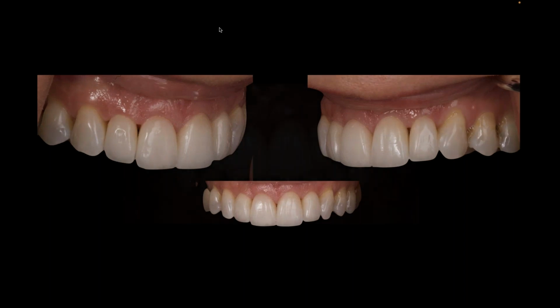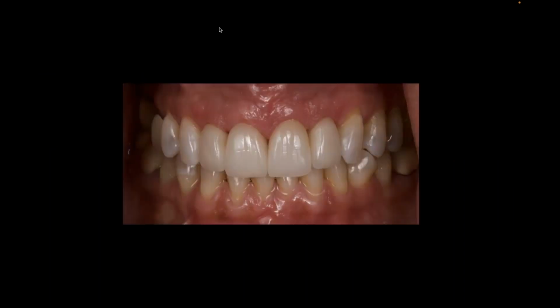And in the end, this was all on insertion, so I didn't get the tissue to fill back in at this moment, but it filled in. We're very confident of that based on the marginal positions. And this is on insertion, so she's still numb, but you can see how everything blends. We've got the color that doesn't look too fake or too bright. It blends into the arch and works well for that patient. And of course, she's still numb, so she's looking a little funny as she's trying to smile.